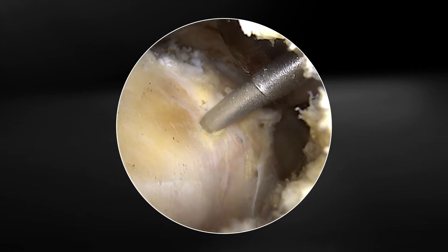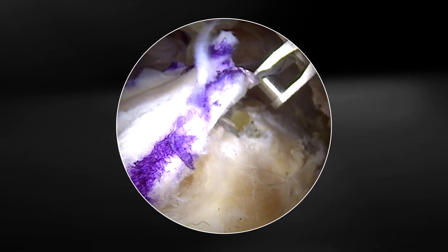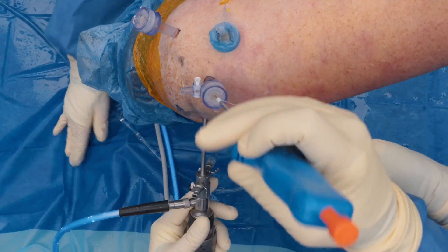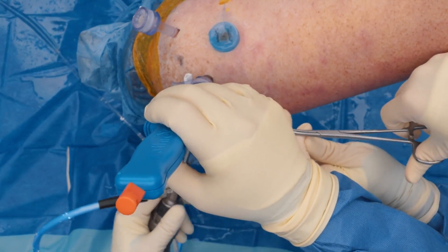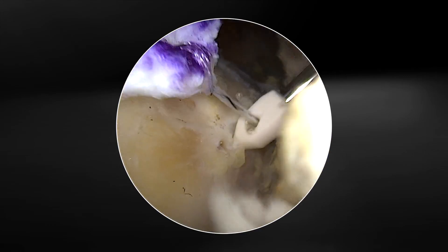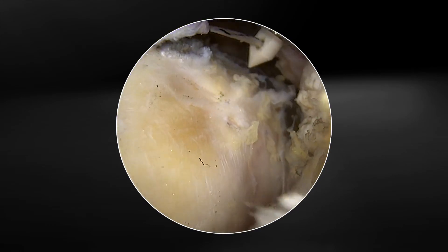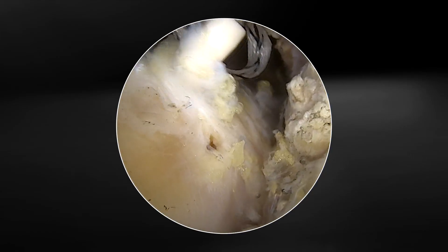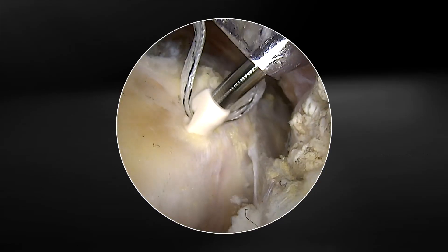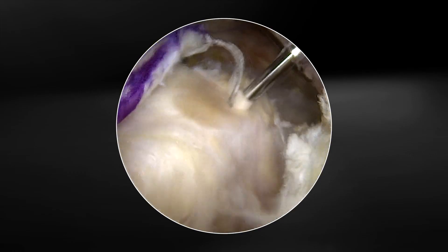We're now getting into pretty hard cortical bone, so we felt that was best done through the traditional lateral portal, and so I'm going to have to retrieve our stitch through this passport. We're now simply going to load it on our push lock. You can see we have the self-punching push lock for our lateral row. One thing that's important is that we leave some slack in this lateral row so as not to over-tension the patch. What we like to do is pass point quite a ways to leave this slack in place, and then come back — we can always take up slack — then this push lock can be punched in directly.